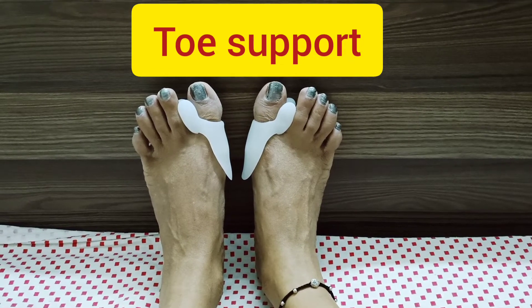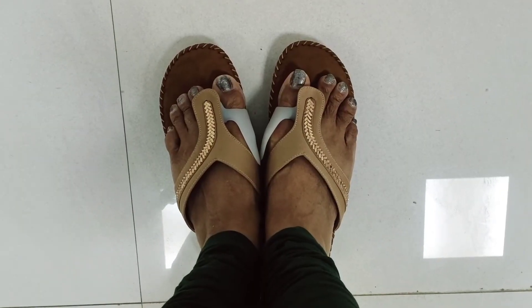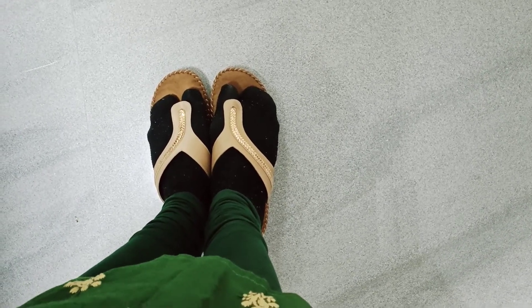You can also wear a toe support. This is how you are supposed to wear it. If you are uncomfortable, you can wear socks over your toe support.